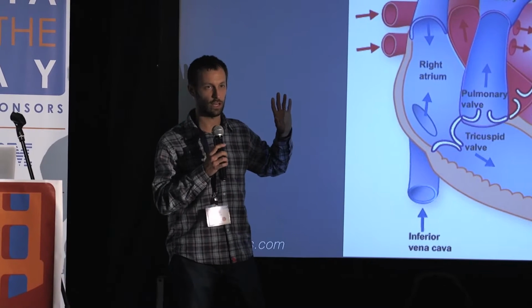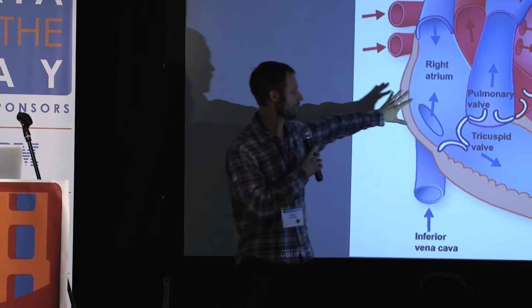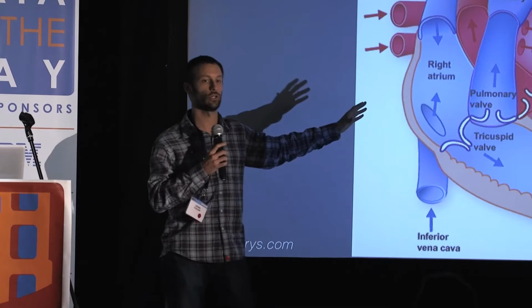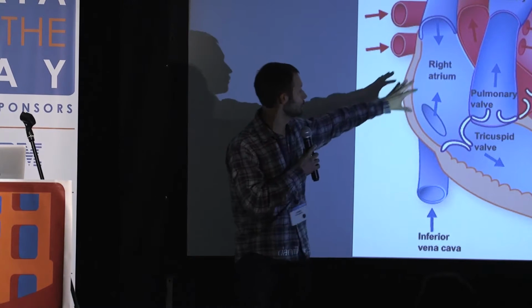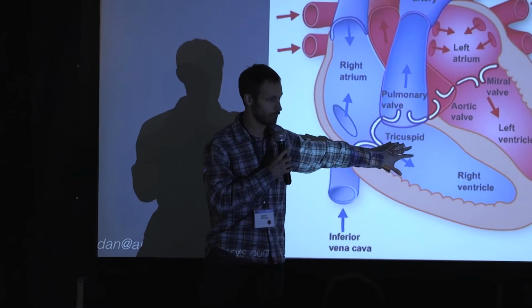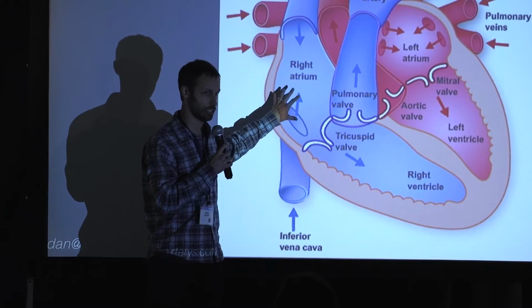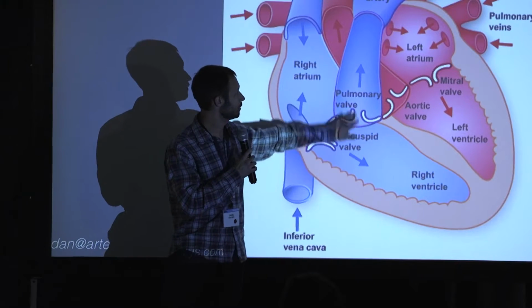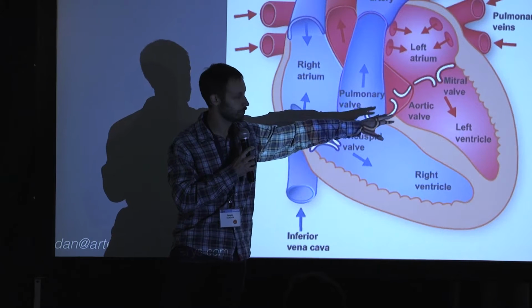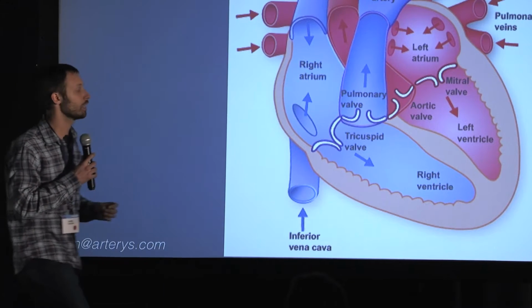And as a caveat here, in standard cardiac views in MRI, the right heart is on the left on the screen. So they're reversed here. It's as if you're looking at the patient face on. So deoxygenated blood comes in here to the right atrium, flows into the right ventricle. The ventricles are the actual pumping parts of the heart. The atria are staging areas. Pumped from the right ventricle into the lungs, comes back into the left atrium, left ventricle, and the left ventricle is responsible for pumping it to the rest of the body through the aorta.